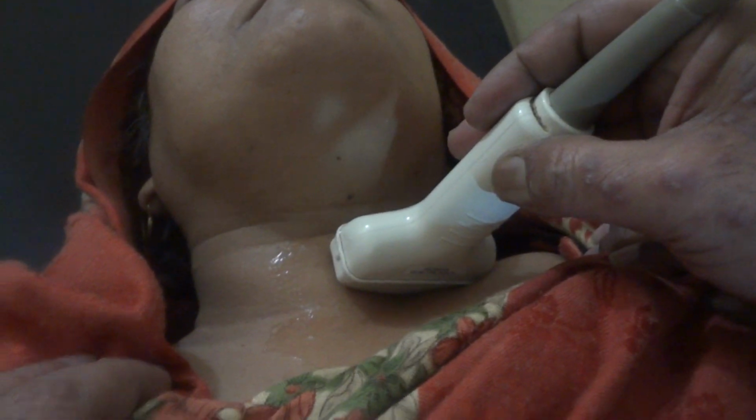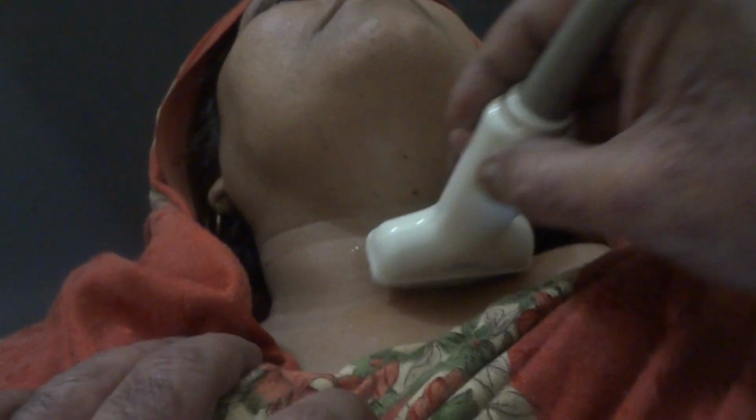You place the probe transversely, get the maximum of the thyroid you can, and then move the probe towards the left or to the right of the patient, and where you get one lobe, here as we are moving towards the left, you will get the left lobe, and now angle it 90 degrees to get the longitudinal section of the thyroid.